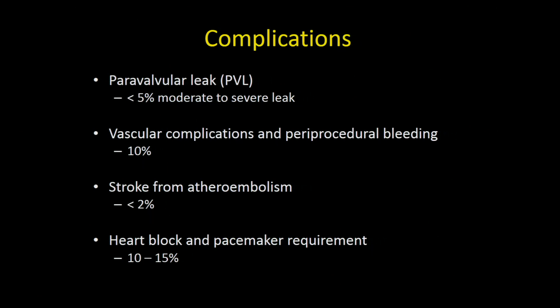Stroke was also a very feared complication. There was a much higher risk of stroke, about 8% in some of the earlier studies. Now that risk is down to 2%. You can imagine you've got this very calcified valve. You now either inflated a balloon or put a new valve in there. You're disrupting that calcium. Does some of it go up to the brain and cause a stroke from embolism? That's sort of the etiology.